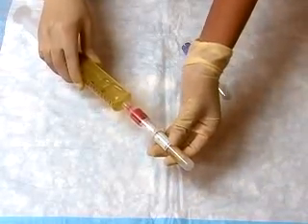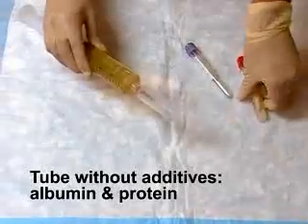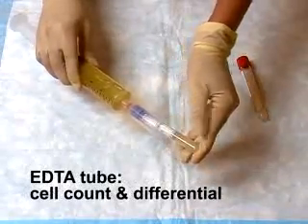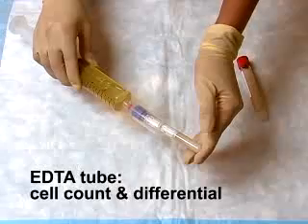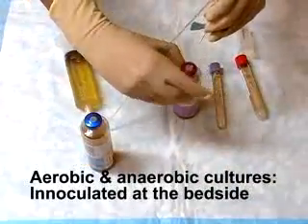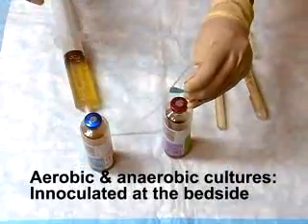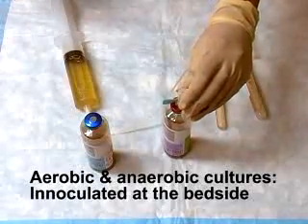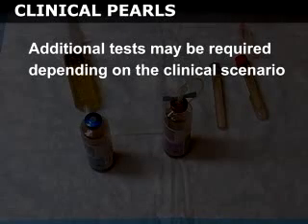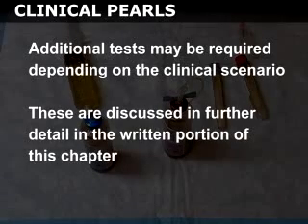In general, a tube without additives is submitted for albumin and protein analysis, and an EDTA tube is submitted for cell count and differential. Aerobic and anaerobic culture bottles should be inoculated at the bedside if infectious etiologies are of concern. Additional tests may be required depending on the clinical scenario, and these are discussed in further detail in the written portion of this chapter.